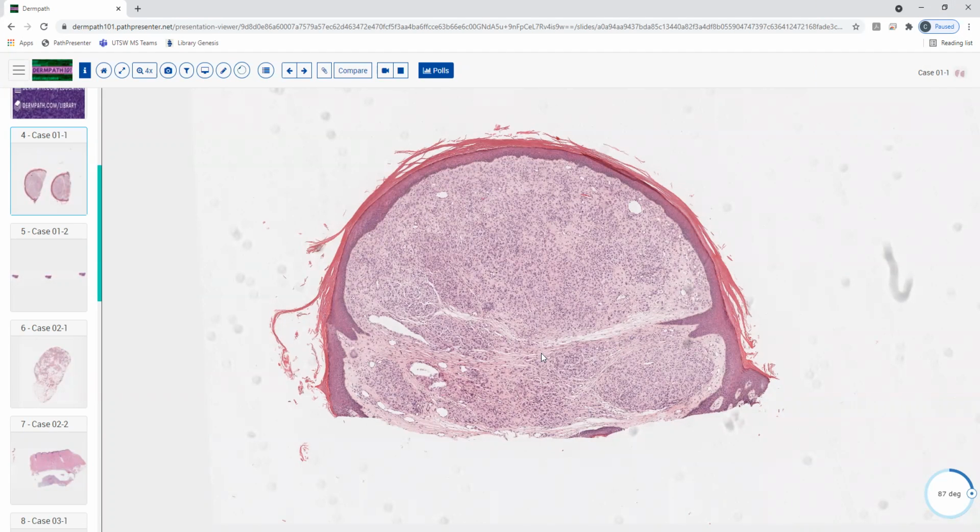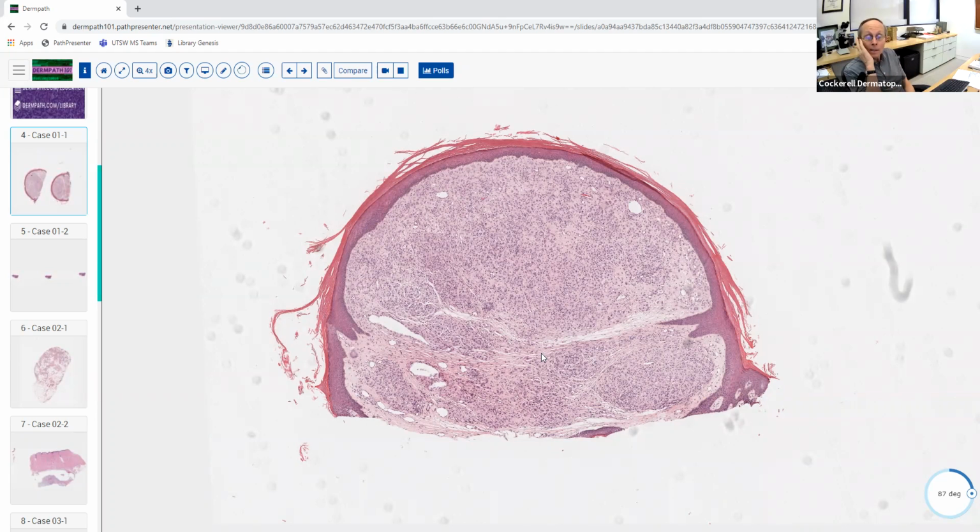Maybe spindle. Good. Spindle. That's the most common, and it's not the only one. Obviously you can get non-epithelial neoplasms that come from the hematolymphoid origin. There are others, like vascular things. But you're right. If you think spindle, you sort of think non-epithelial.